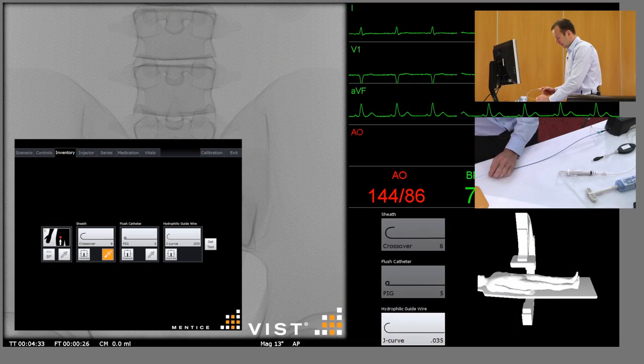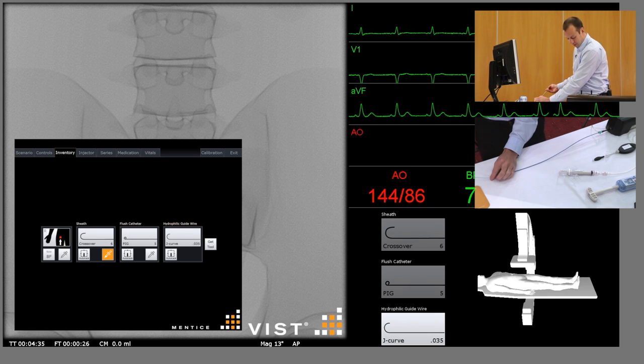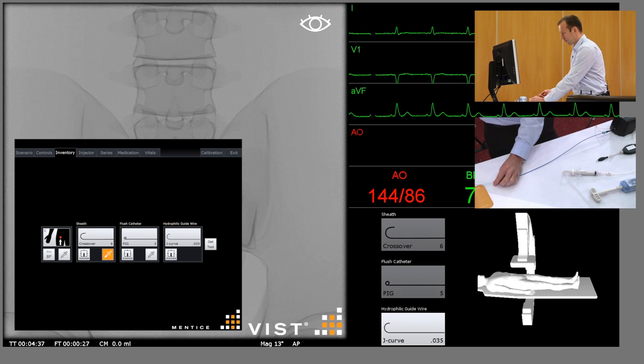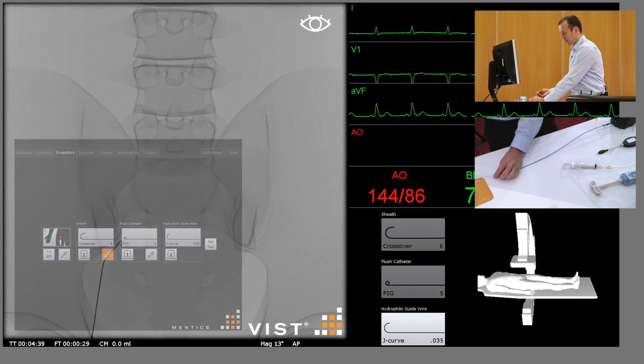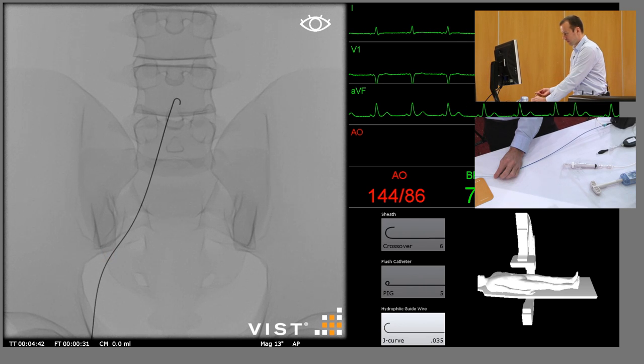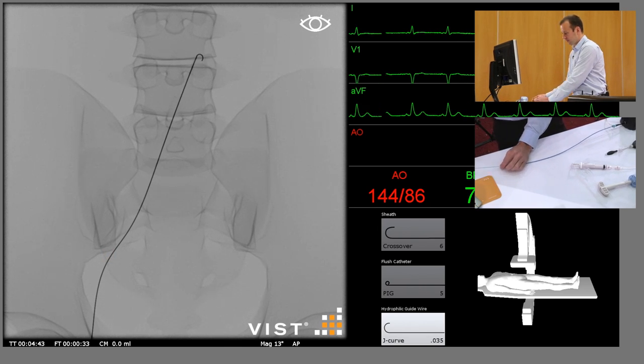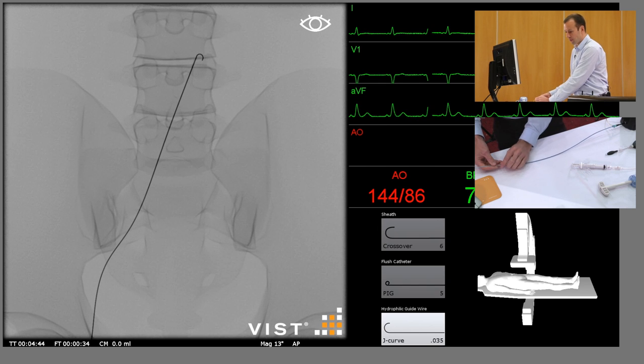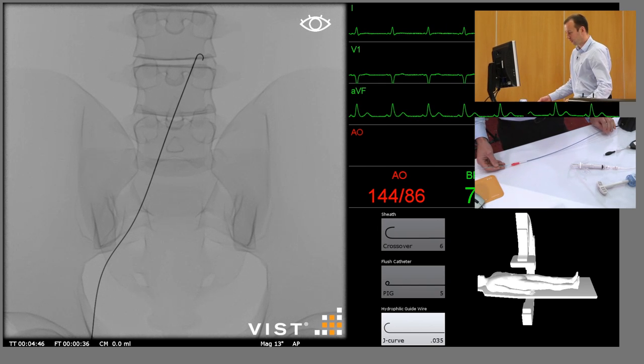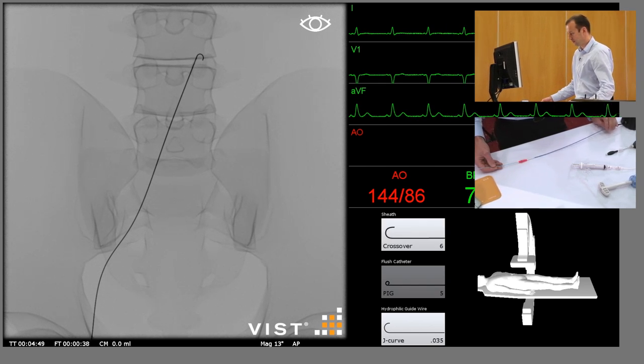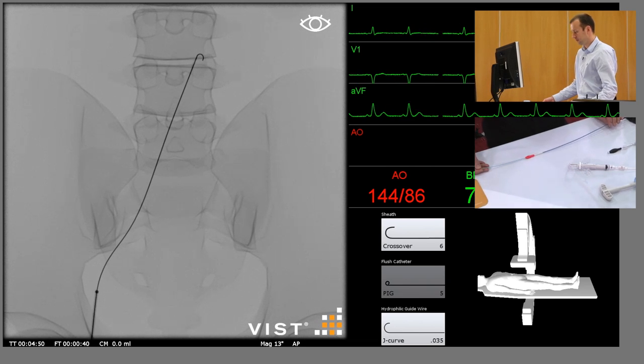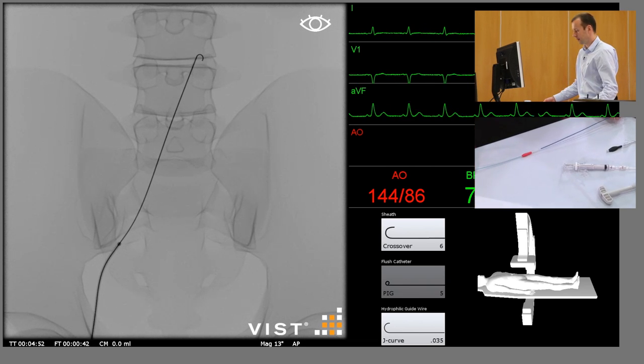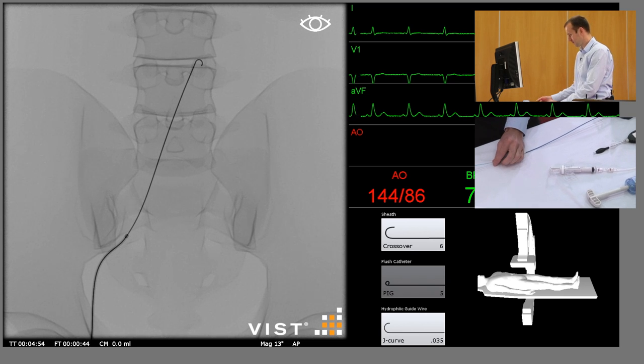We're going to start with the standard J-tip guide wire which will advance into the abdominal aorta, and over that we're just going to insert a six French sheath and we'll leave that in the iliac at the moment.